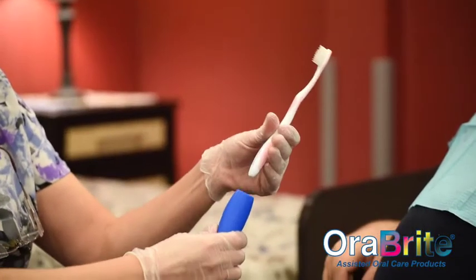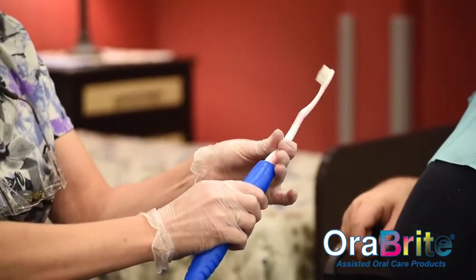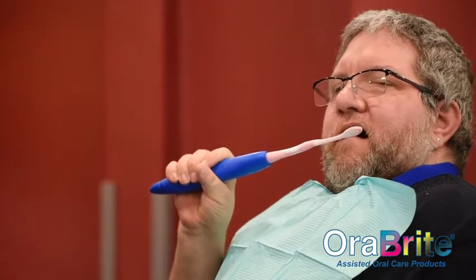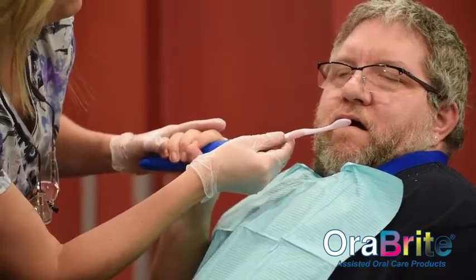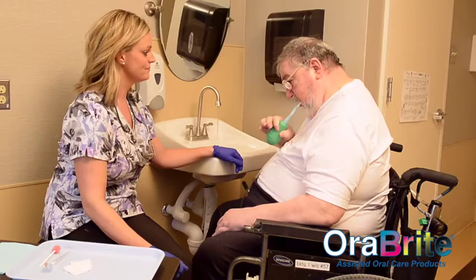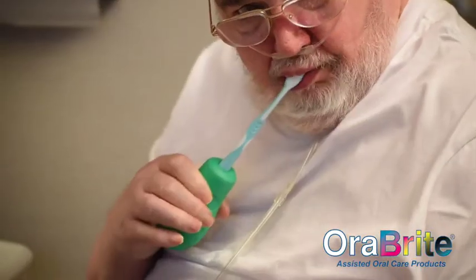The Extender increases the length of the toothbrush about two and a half times, allowing patients with limited range of motion to reach their mouth while keeping the bend of their elbow close to 90 degrees. The Expander provides a wider grip that most manual toothbrushes can fit into.